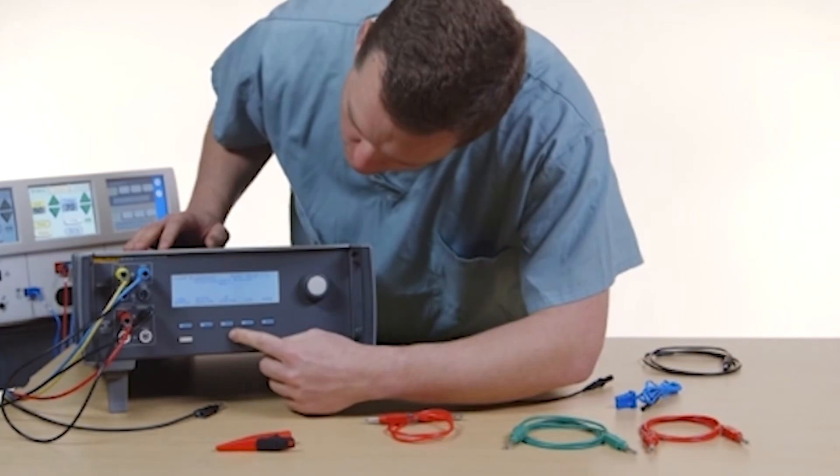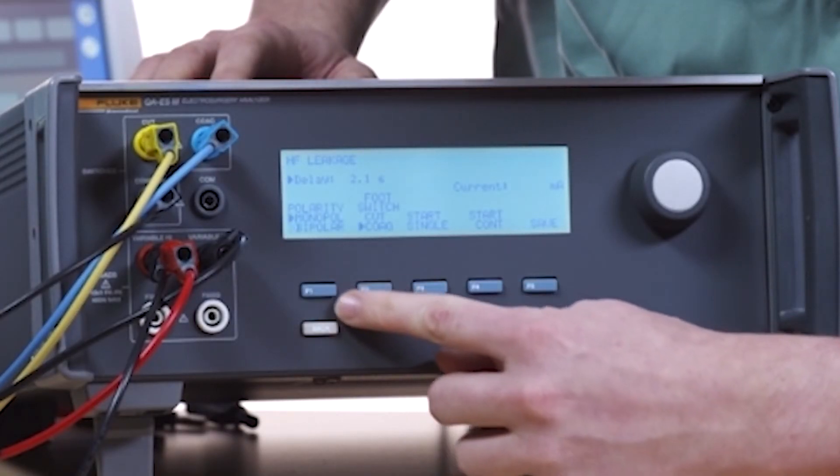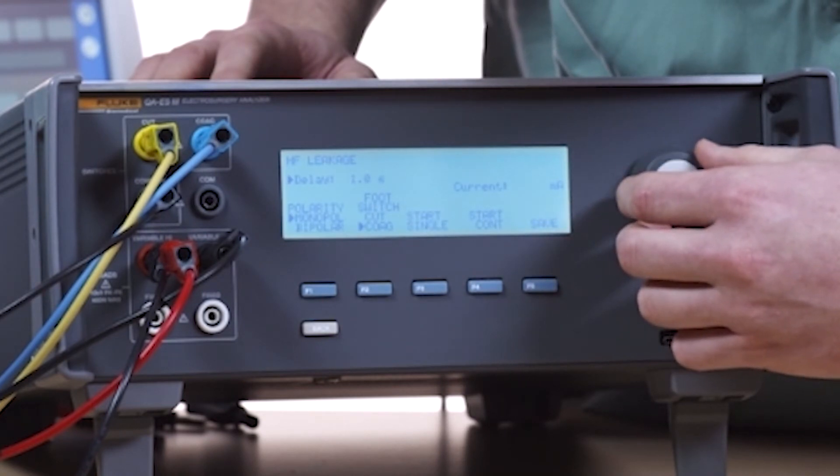On menu 1, select HF leakage. Set polarity to monopolar. Use the rotary knob to set the delay for the foot switch. In this example, the delay is 1 second.